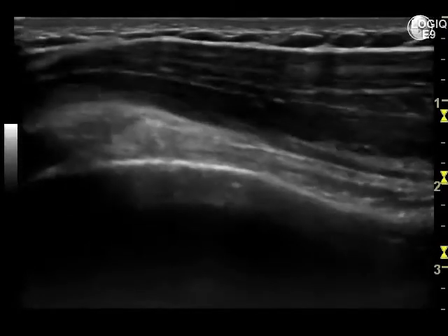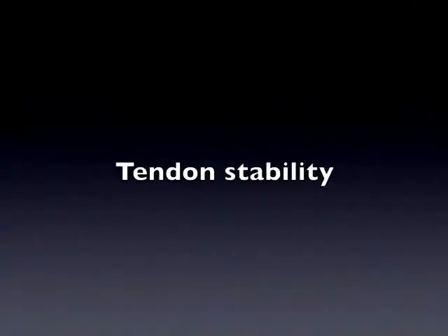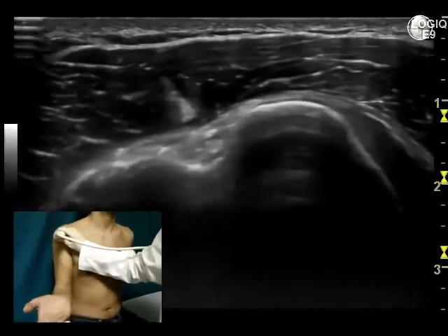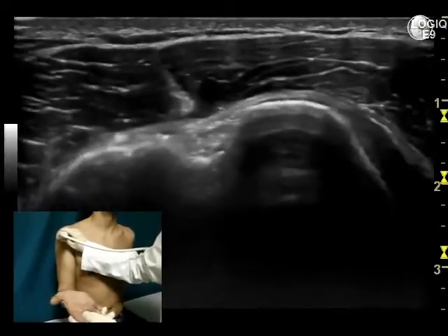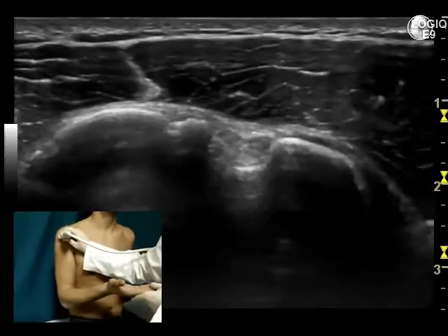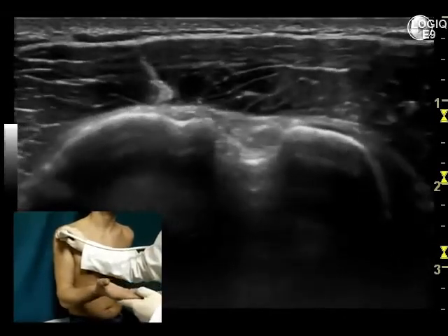Further information about the tendon stability should be obtained by making the patient abduct the flexed arm, and at the same time, holding the probe on the bicipital groove with an axial scan. In normal conditions, the tendon should be seen within the groove during the entire maneuver.